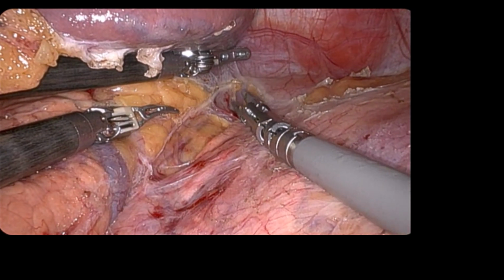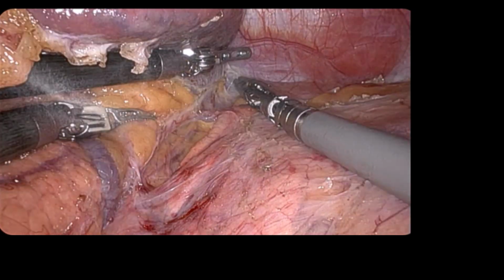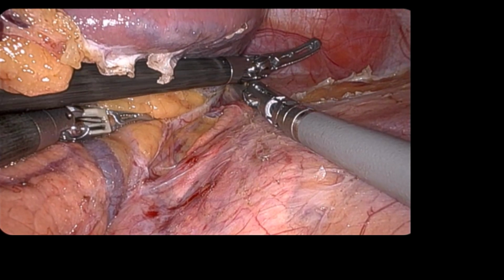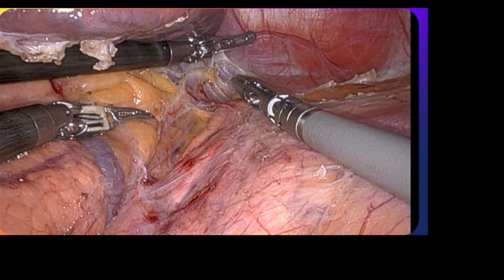Overall, I personally think the paddle retractor is the best retractor out there for adrenalectomy, especially on the right side. On the left side, if you fully mobilize the spleen, sometimes you can complete the operation laparoscopically without a retractor for the spleen and pancreas.